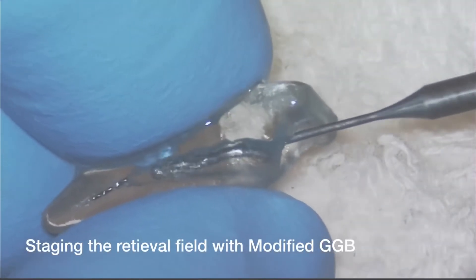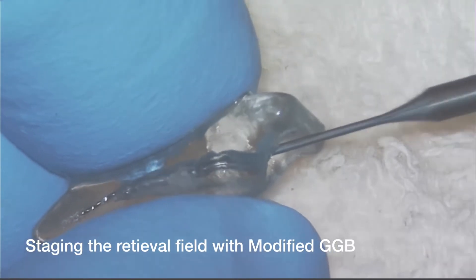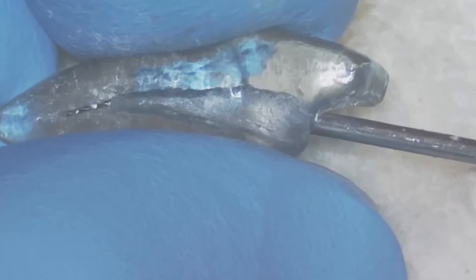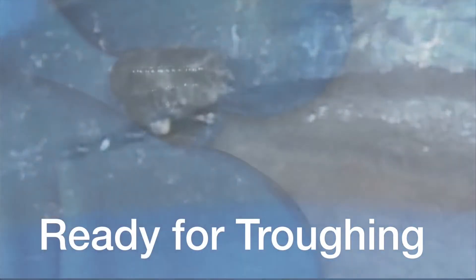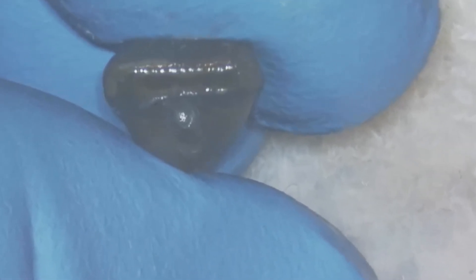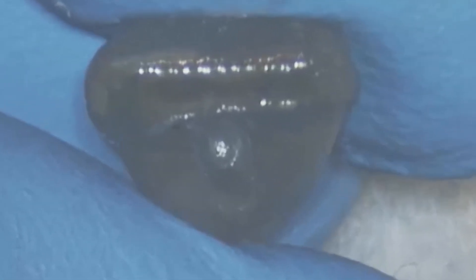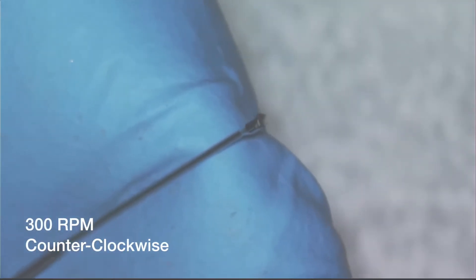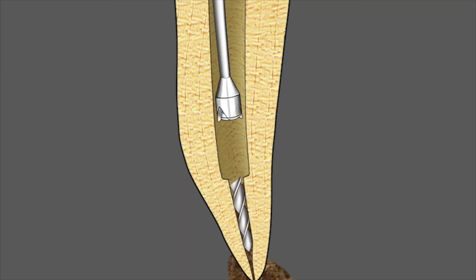Now let me demonstrate in a TrueTooth training replica the use of each of these instruments. We first need to stage the retrieval field with the number three modified Gates Glidden Burr. Notice the little platform there — we're ready for troughing. It's really helpful in the cases where, after this initial Gates use, you can see the instrument. Next, the Treffine Burr will be brought into the canal to start the troughing process around the separated instrument.